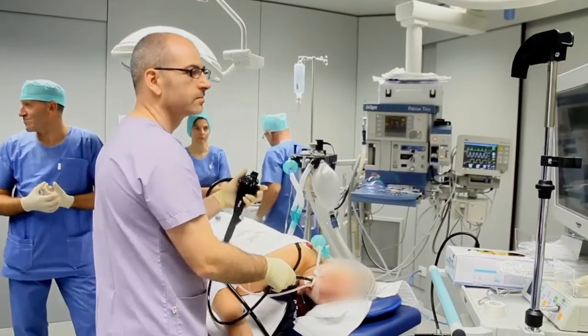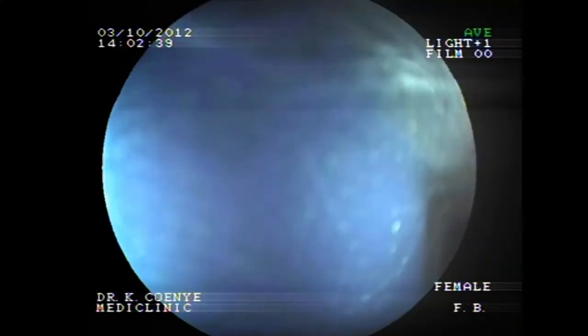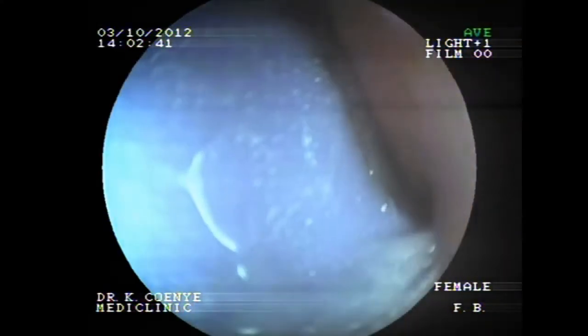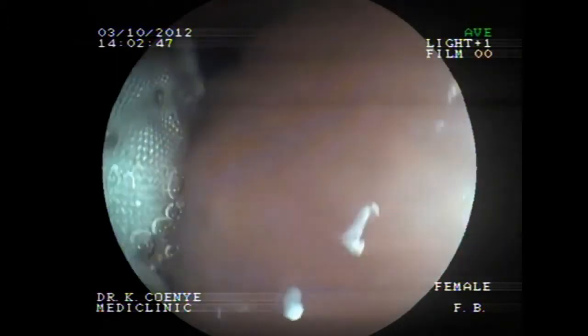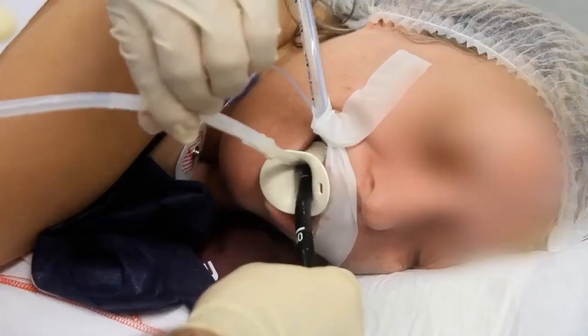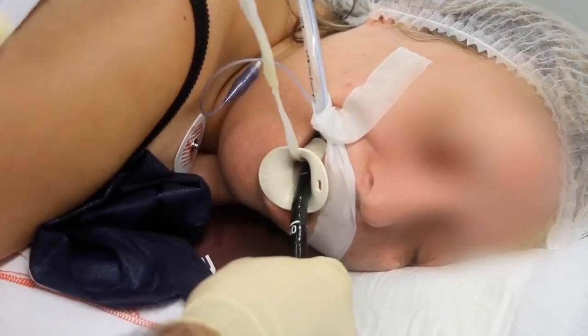The entire procedure must be carried out under endoscopic control. Once the balloon is released in the gastric cavity, check that the inflating cannula does not exceed the distal end of the catheter. If it does, it could damage the esophagus during the removal of the introduction system. Then, delicately remove the introduction system under endoscopic control.